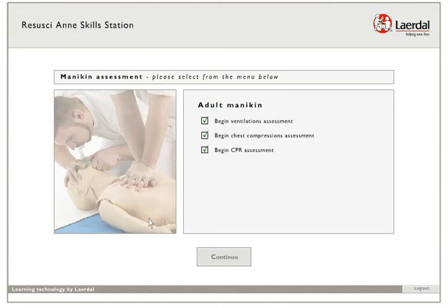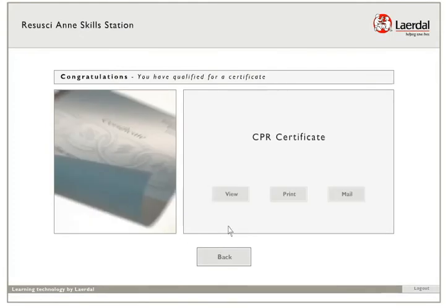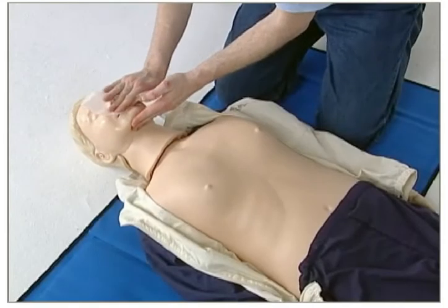When all assessments are passed, press Continue to claim your certificate. Select View to see the certificate on the screen and select Print to print a copy for your records. The system will automatically register your completion in the electronic records.